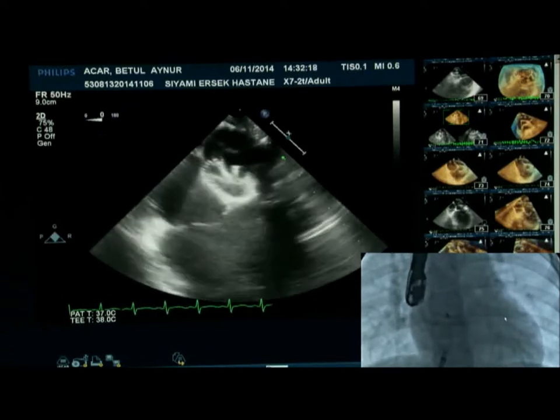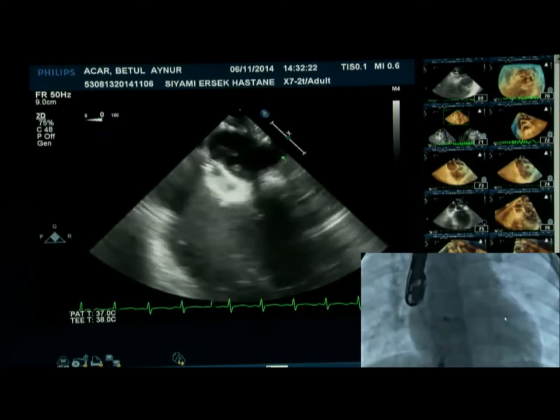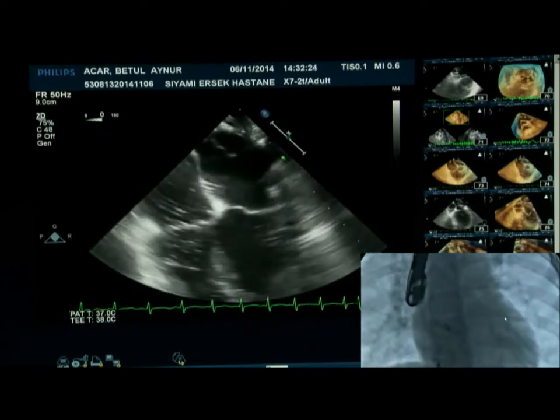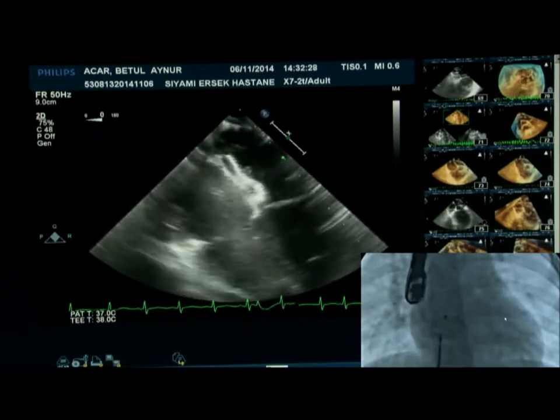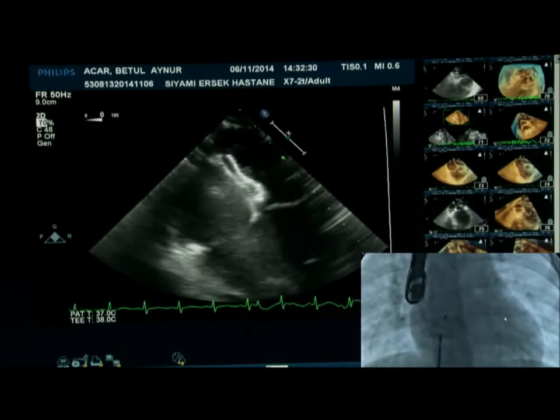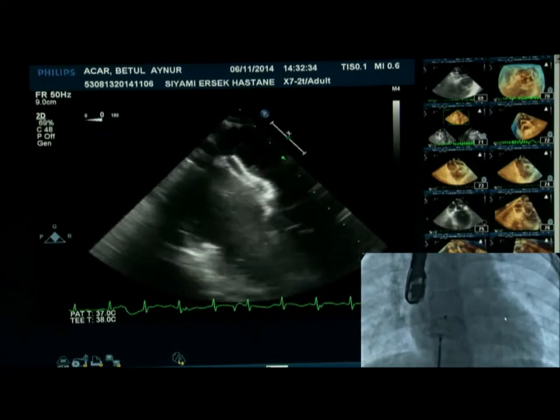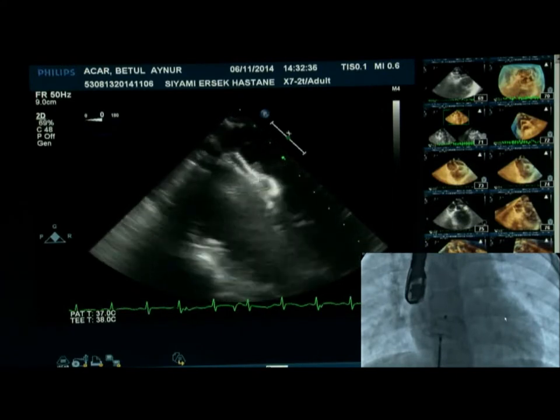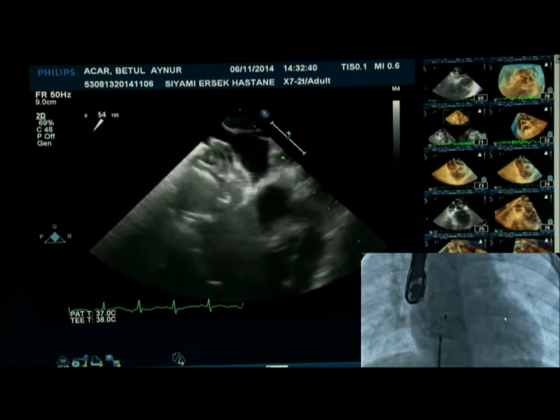Yeah, okay. And then if you keep that and then pull the sheath back, yeah? And now push ahead, yeah? All right, the right atrial disc, if you cine that, the right atrial disc is delivered. Now if we can have a look on TOE to make sure we're on either side of the septum. Can you do a cine? Cine.